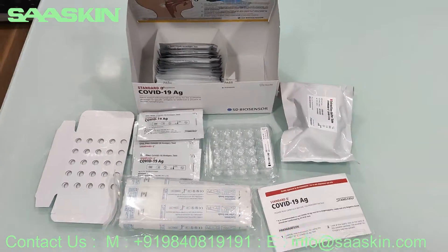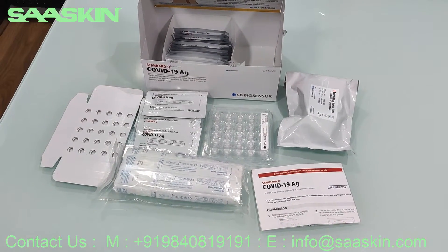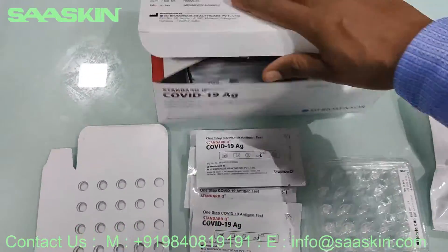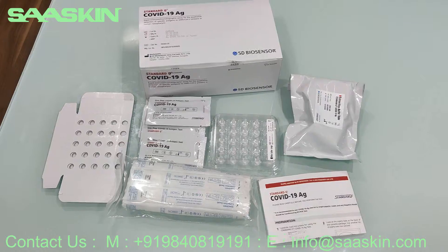This gives you a complete idea about the contents of the Standard Q COVID Antigen Test Kit. Let me close this box for you. This is how the box looks like with all its contents.